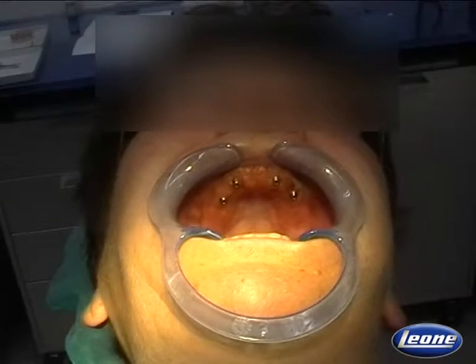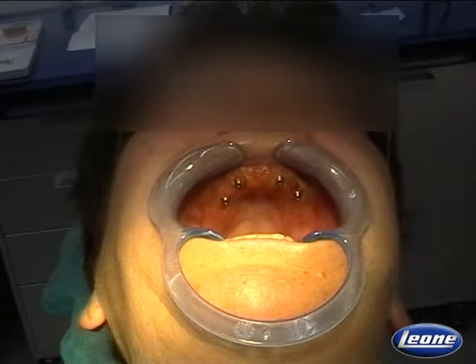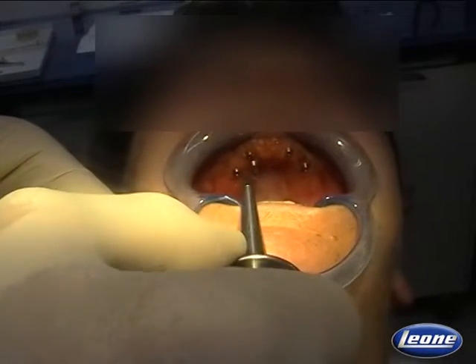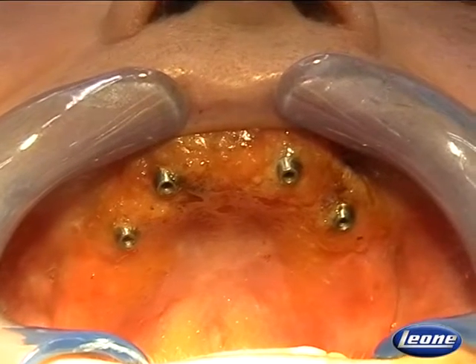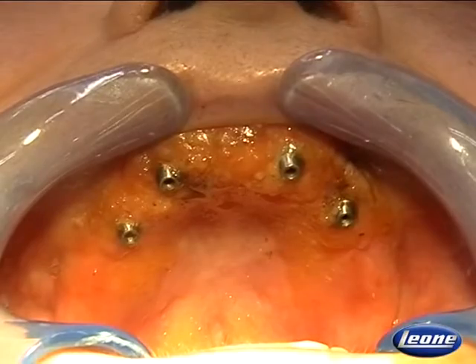the selected position. Just this moment I have removed the healing caps and seated the abutments into the implants. We are now going to activate the Morse taper connection using the specific abutment beater. As soon as the abutments are permanently connected, we can acquire the position of the abutment in the mouth.